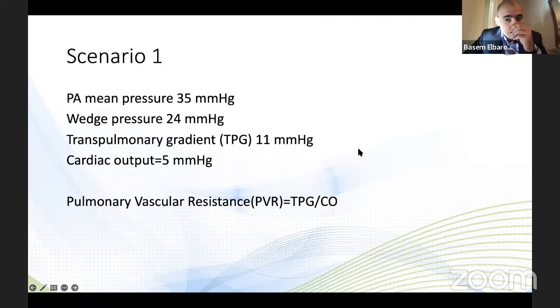I don't know what our cardiac surgery practice is, but in general, the routine use of Swans in the ICUs and intensive cares has been abandoned a while back because one big randomized trial didn't show any benefit and actually showed increased mortality. The problem is it's a diagnostic test. So if you're using it in the right context where you're not sure what the diagnosis is, or you know what to do with the numbers, then it makes sense. But I'm not sure that there is a role for routine use in most places.